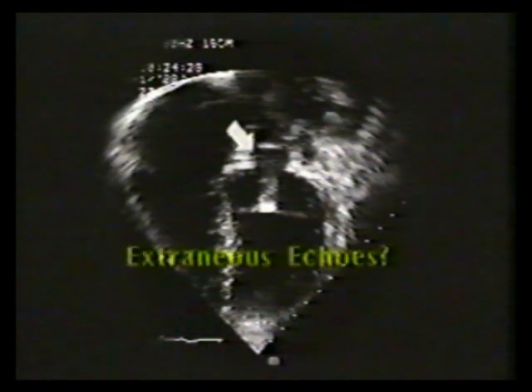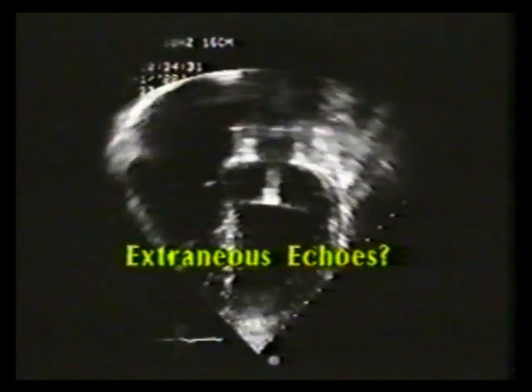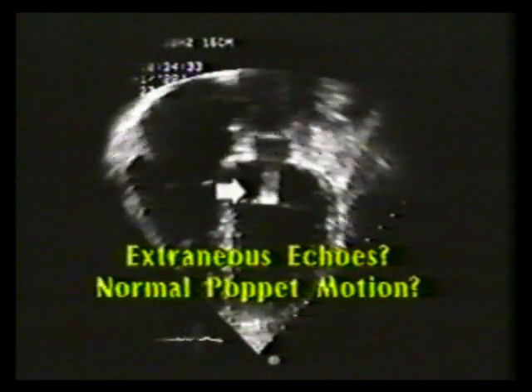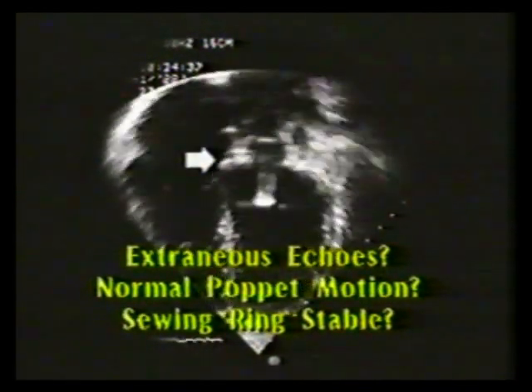In this diastolic frame, echoes are noted in the left atrium. These are reverberations from the prosthesis. Each type of prosthesis has its own characteristic reverberations. As each prosthesis is inspected, the echocardiographer should determine if there are any other extraneous echoes that might represent vegetations or thrombus. In addition, the echocardiographer should see if poppet excursion is normal and if the sewing ring is stable and free of rocking motion.